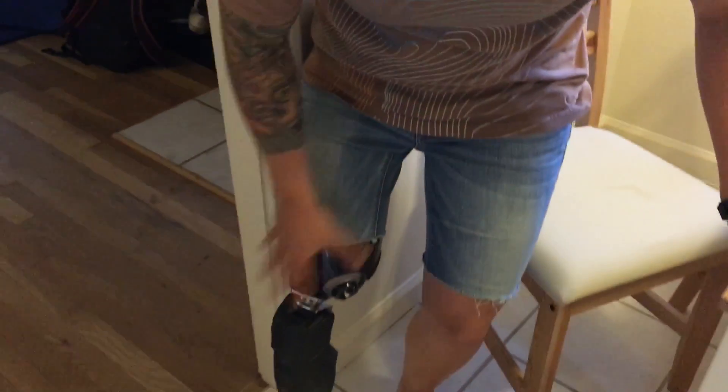Hi, it's Danny Burt. I have some advice for you for a suction socket for an above knee prosthesis. This is my socket.